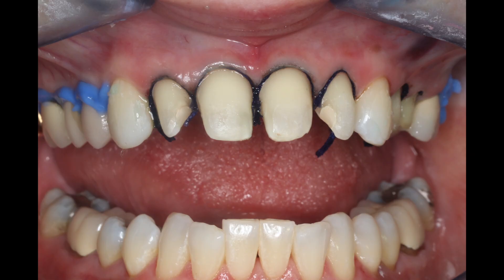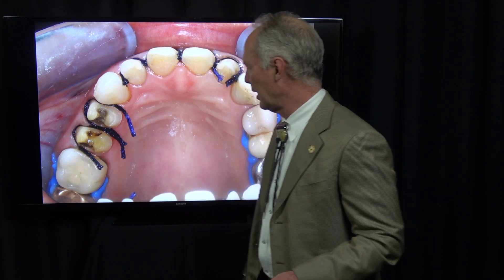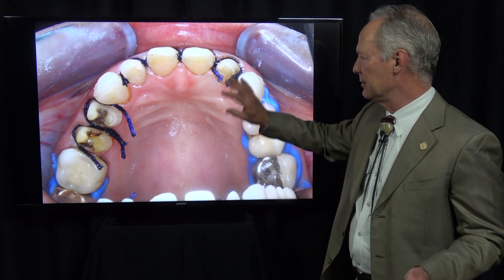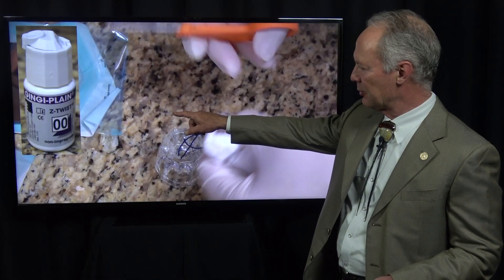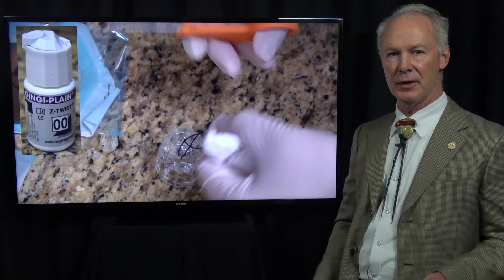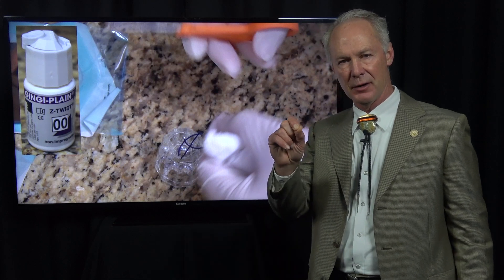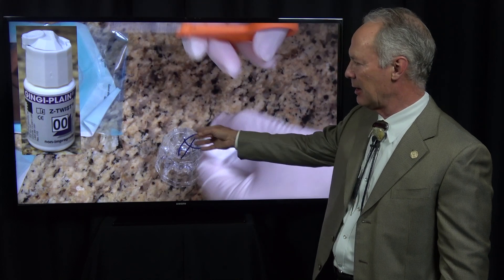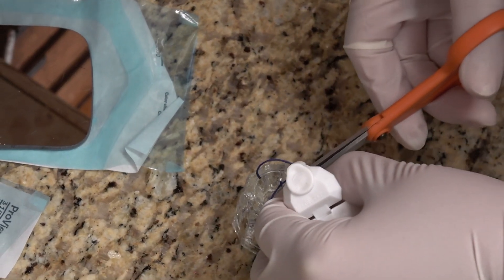In this case, we've prepped four maxillary anterior teeth for veneers and two bicuspid teeth for full crowns. We're going to have videos on all parts of this. This is the Gingiplane Z-Twist 00, non-impregnated, and this is the cord I use 99% of the time. We've got some smaller cords we'll use occasionally, but 99% of the time I'm using the Gingiplane Z-Twist 00.